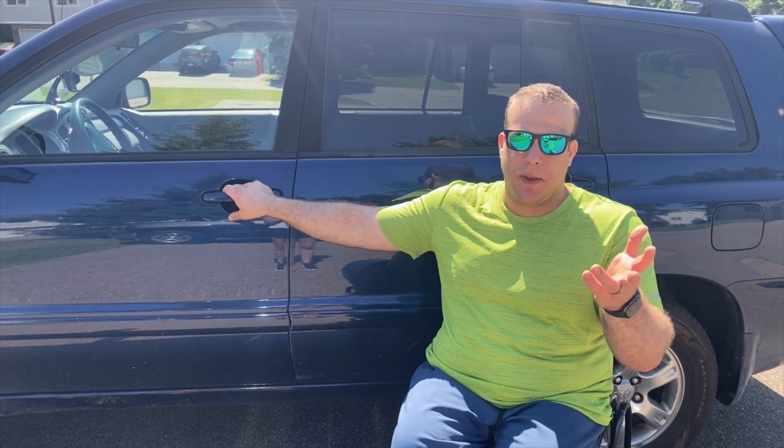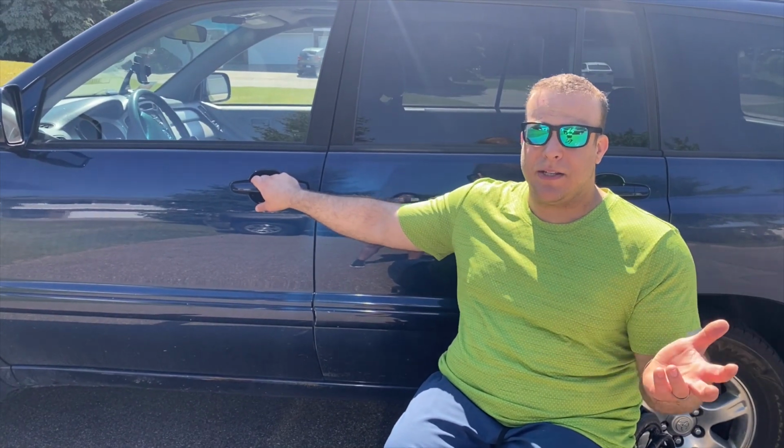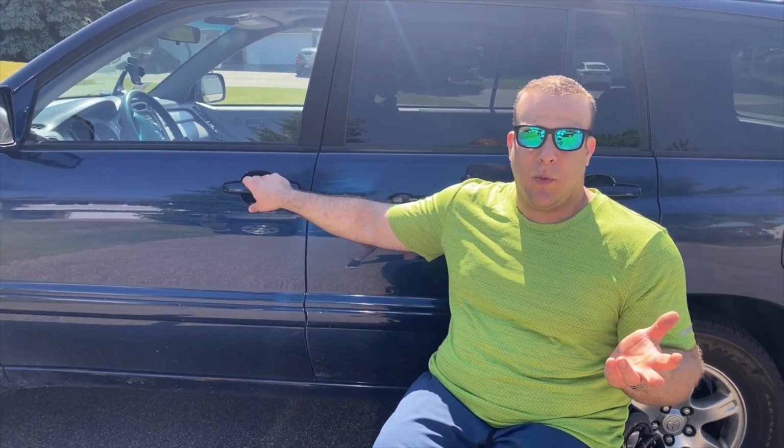So this car that I've had since Andrea and I got married, basically, was my first car where I was having to take my chair apart to get it in. And kind of what we were talking about, people having questions, I have gotten the question of, can you only drive a minivan with a lift? And that's actually not true. If you have the upper body strength to be able to pick your own chair up, the sky's kind of the limit for what vehicle you could drive, to a certain extent, because some are just going to be too small to fit a chair in.